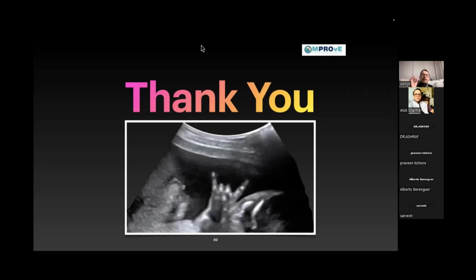If it is a B profile, compact B line, severe RDS baby, and you are trying to do M mode, do I see a seashore sign or a sandy beach sign? Yes, I do. If it is a baby who has got a collapse consolidation, and there is a paucity of pleural sliding, I'm not very sure that there is a pleural sliding, and I try to interrogate with the M mode. Do I see a seashore sign? Yes, I do.